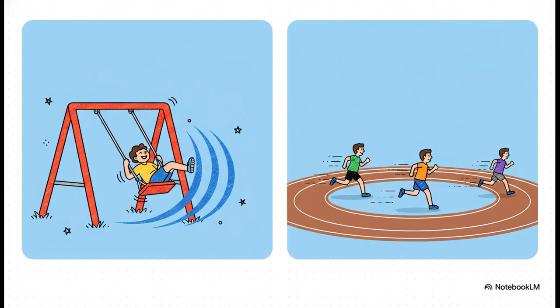Okay, this brings us to 2 incredibly helpful quantum analogies you're going to want to keep in your back pocket for exam day. First, think of that RF pulse like pushing a kid on a swing set. If you push at the exact right moment, the right frequency, meaning the Larmor frequency, you transfer energy perfectly, and that kid swings higher. That's resonance. Now, right after we push them, all the protons are spinning together perfectly, in sync. They're in phase. But the second we turn that RF pulse off, they start spreading out. And that brings us to analogy number 2, the marathon. Imagine a bunch of runners starting a race packed tightly together. Pretty quickly, they're going to spread out because, well, some run faster and some run slower, right? Our protons do the exact same thing. They quickly lose their phase coherence.